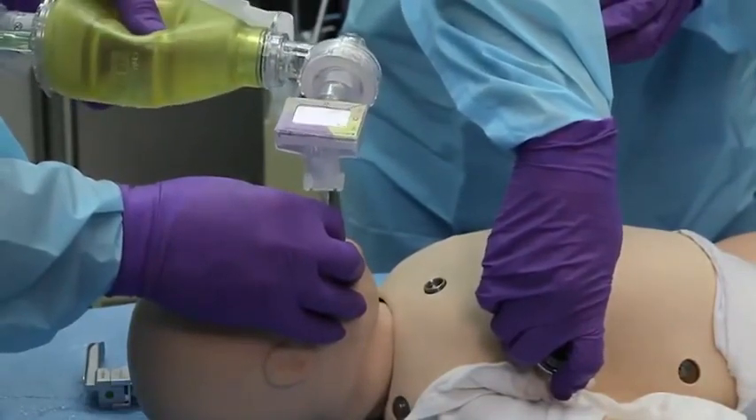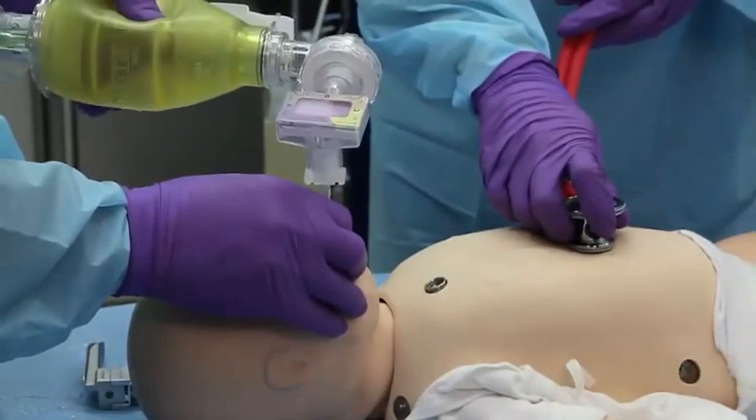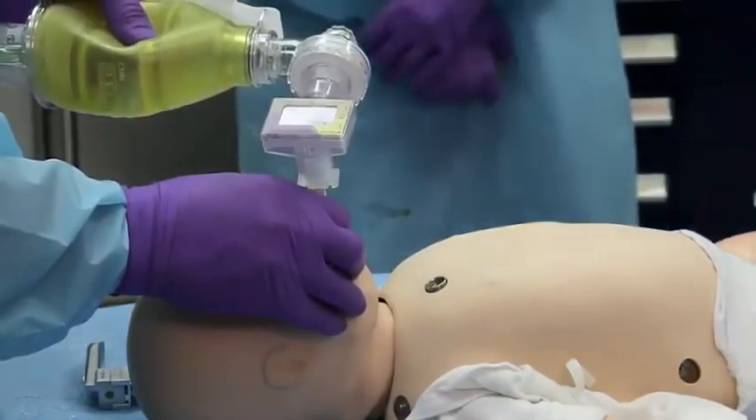If endotracheal intubation is not accomplished within 30 seconds, or the time it takes to hold your breath before exhaling, discontinue attempts, ventilate the patient with a bag mask device, and try again.